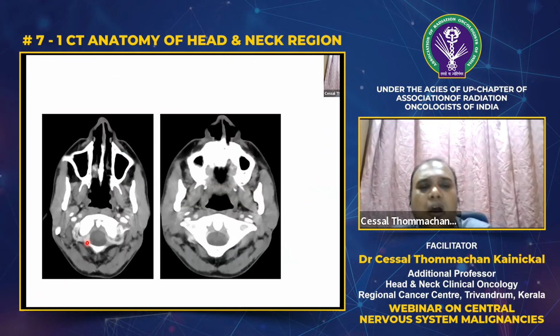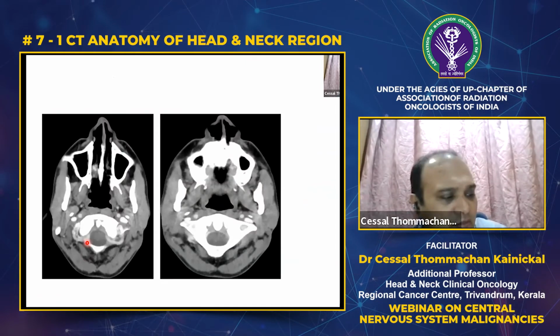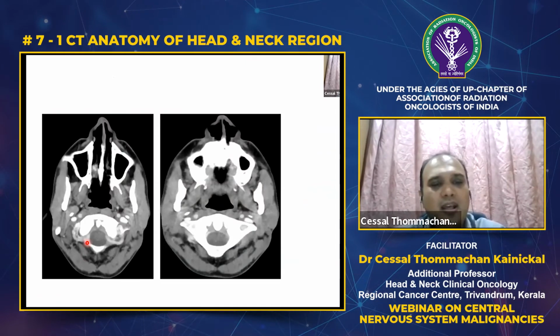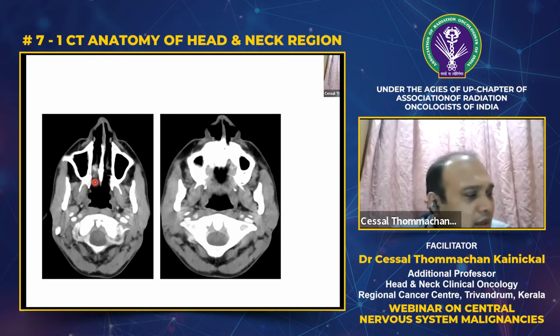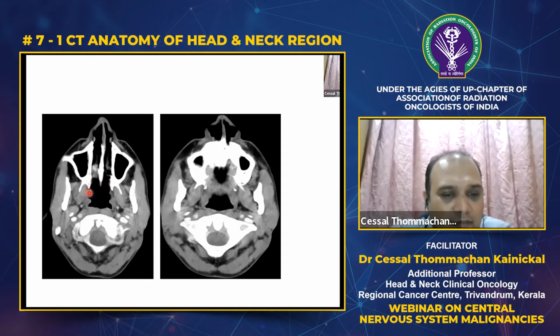Right. So how is it reflected in a CT scan? Okay, it is almost 40 minutes. I don't think I will be able to discuss the larynx and hypopharynx today. So I will try to cover the oral cavity if possible.